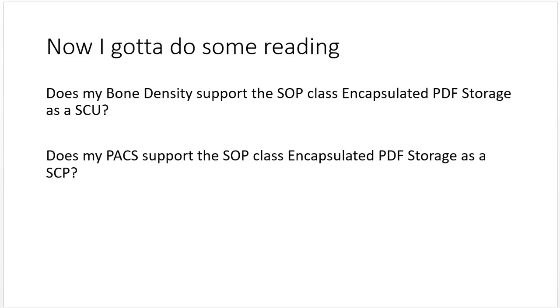Does my bone density support the SOP class encapsulated PDF storage as a SCU? Does my PACS support the SOP class encapsulated PDF storage as a SCP? So this is why we've been teaching you DICOM, so that I can now talk to you like a PACS admin, and I can say, does my PACS support the SOP class encapsulated PDF storage as a SCP? And you understand what I'm speaking, and it doesn't sound like I'm talking in Greek.